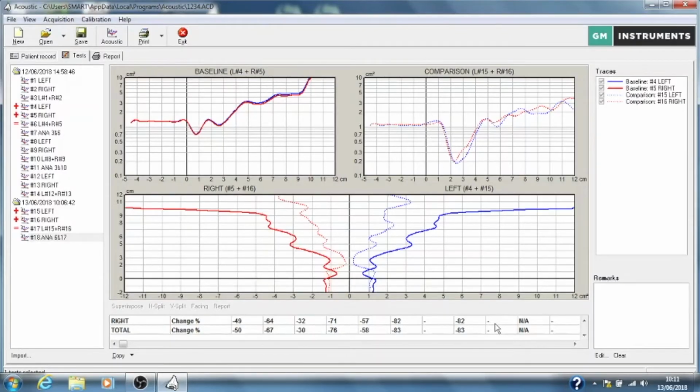Ideally, the traces on the screen should be very tight. There are 4 clicks typically, although you can alter it to a higher number or a lower number, but typically we present 4 clicks, do 4 calculations, take the average of those, and that gives us our parameters and our values. If there's a lot of background noise, that will make those 4 traces a bit more diverse, although we still take the average of them, but better accuracy is achieved if we can have a quiet environment and produce traces that are tight, traces that are very close together.